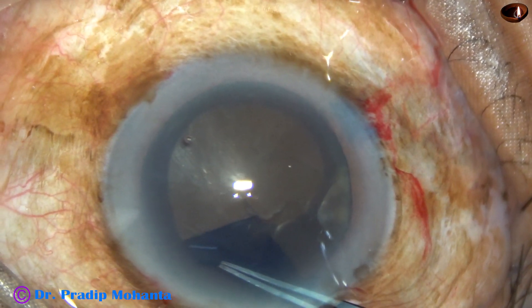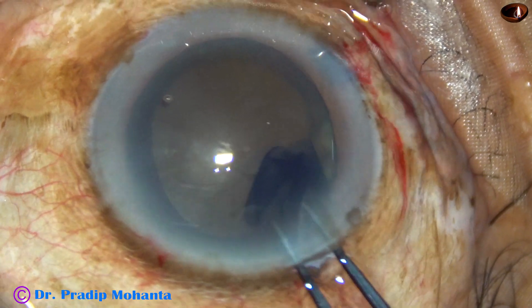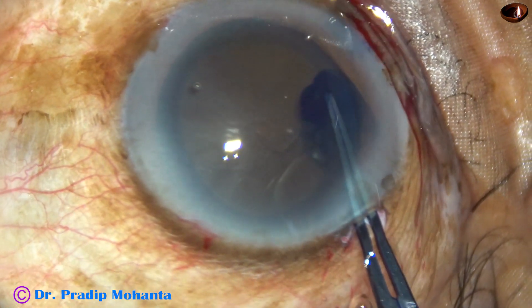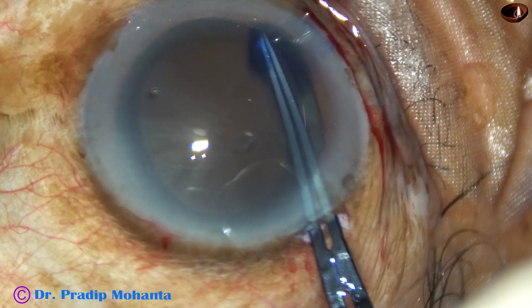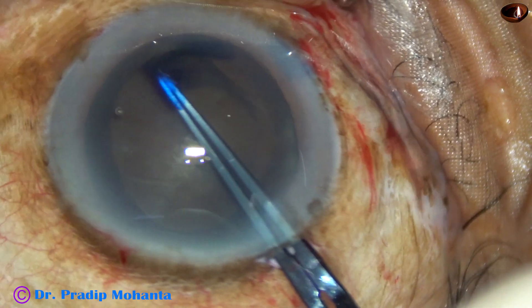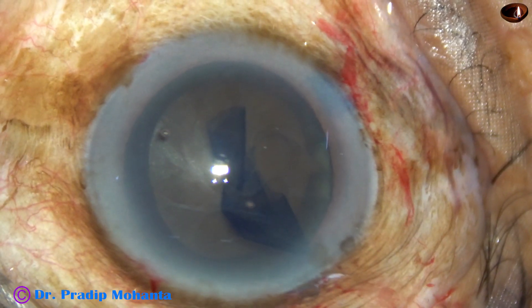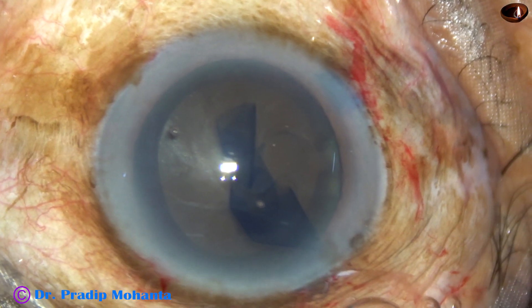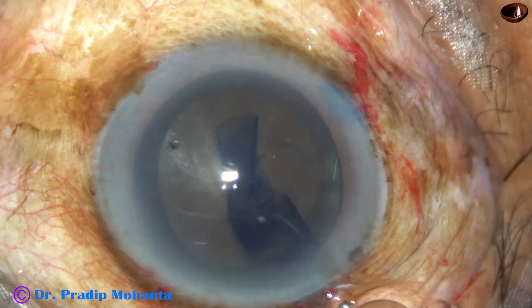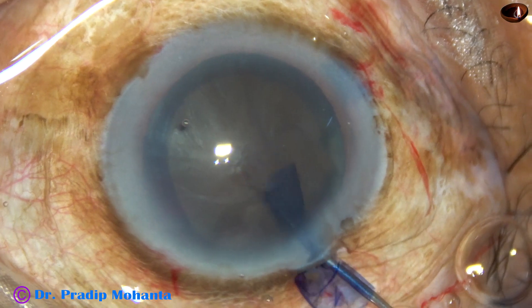Very slowly and in a very controlled way, I want to go to the further periphery to make the rhexis of adequate size. This has been a very nice rhexis. It's not round — we can call it an oval rhexis. And now, hydrodissection.